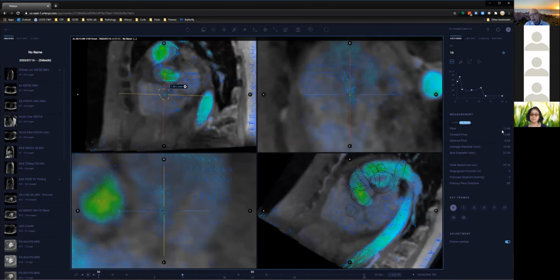But good guidelines for echo, the thresholds are like 30 and 60, which I think a lot of people think are a little bit high thresholds for moderate and severe mitral regurgitation. In practice, in more recent literature, we see the lower limit for severe to be around 50 mils per beat, and maybe 25 for moderate, as sort of a way of bisecting the 50 and 0.